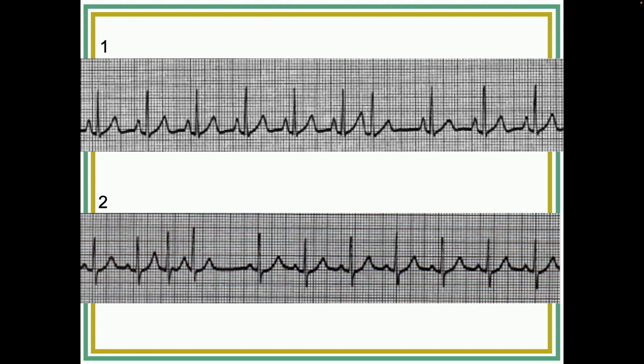Oh, this is ordinary, and then this is ordinary, and then this is going to be a weird beat. Perfect, okay. So what do you think about the ordinary stuff, the underlying rhythm? I thought it was pretty normal. Normal meaning regular? Yes. Regular upright P's and T's, and then I used the 300, 150 method. And what'd you come up with? I got around 90 beats per minute.